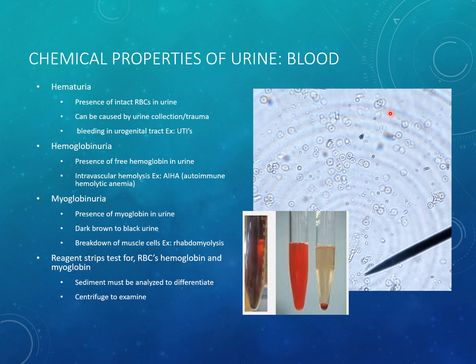By the way, red blood cells, this is what they look like in urine unstained. They look like little donuts, little tiny circles. This is the needle, and in comparison to them, this is the size that they would be under the microscope. When we have whole red blood cells in the urine and we spin it down, the urine may appear red at first, but if they're whole red blood cells, they're going to separate out during and after being centrifuged, and then we're going to have them just down in the pellet where all of the sediment is, and the regular urine will not appear bloody because that pigment is all inside the cells.